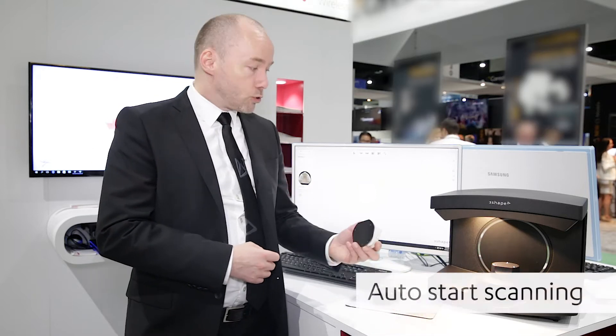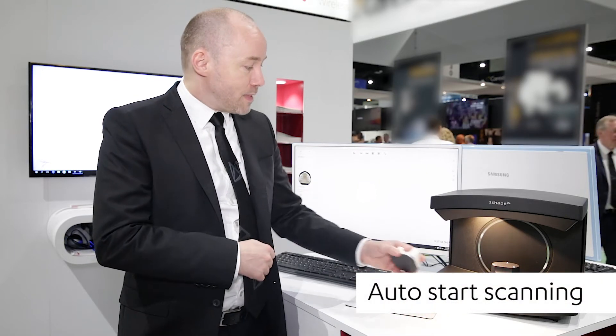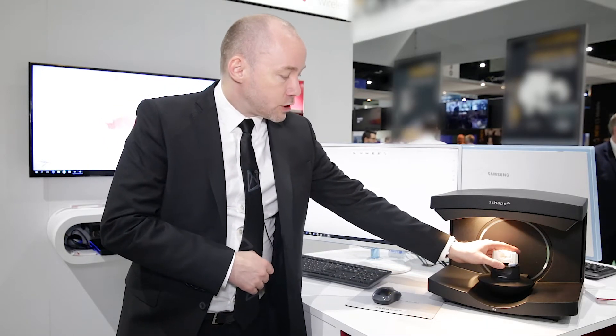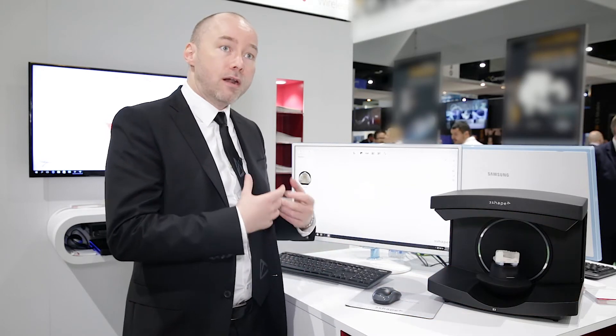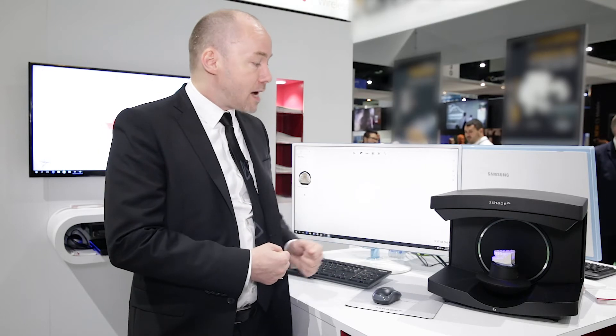A good example of that could be the auto start. There's no cheating here — I'll put in the model and as soon as I let go, the scanner will detect that I have put an object into the scanner and then it will start scanning.